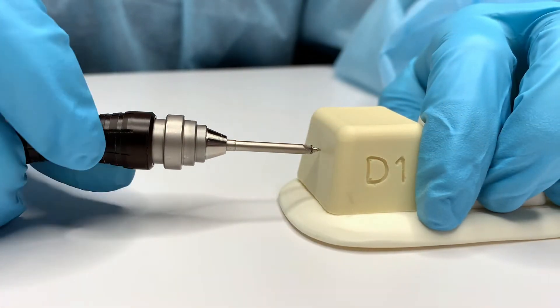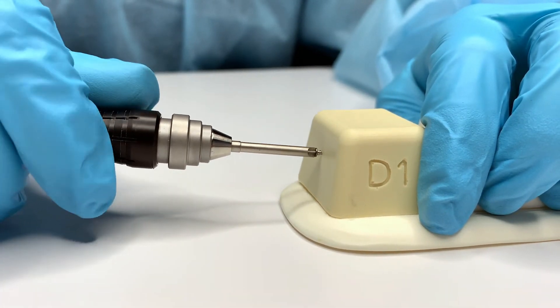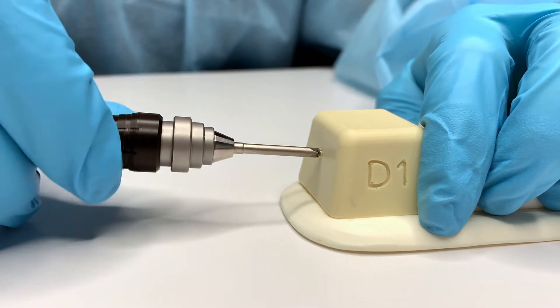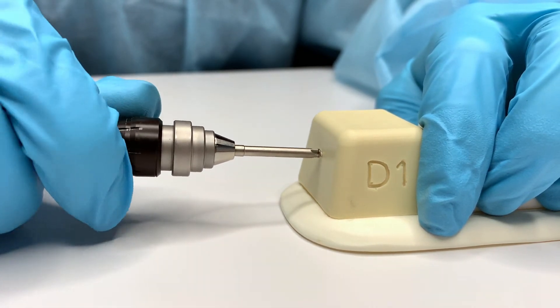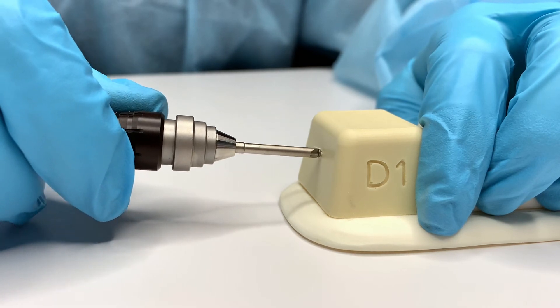Because of this connection, it is important to properly disengage the screw from the driver blade once placed in bone. Once the screw is in its final position, release the connection by moving the handle at a 45-degree angle.